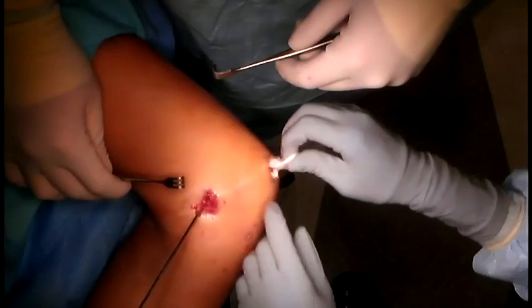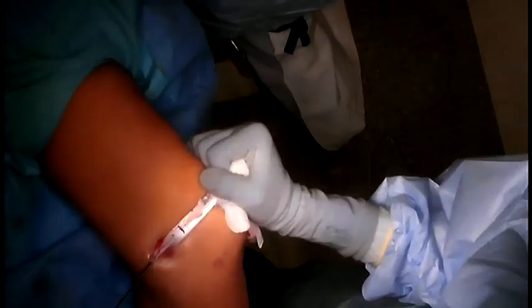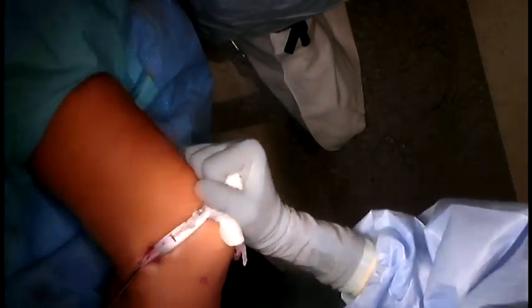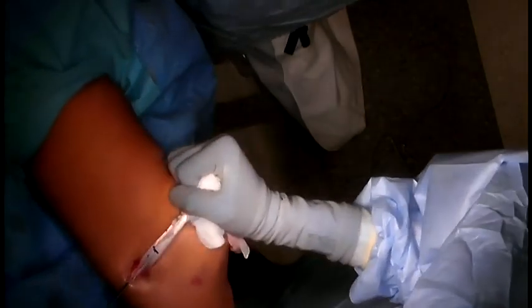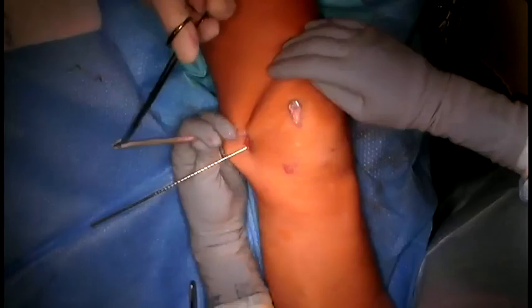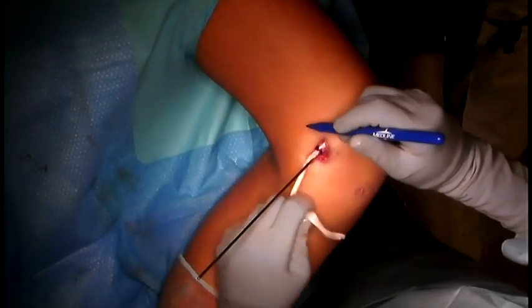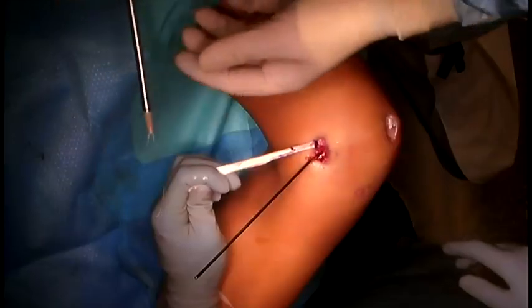The isometric function of the graft is then assessed to confirm less than 5 mm length change of the graft between 0 and 70 degrees of flexion. Once this is confirmed, the graft is passed between layers 2 and 3 and retrieved at the site of the femoral tunnel. The knee is brought to approximately 60 degrees flexion and the slack is removed from the graft.